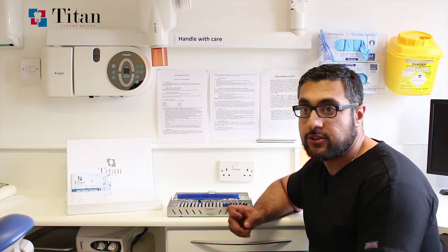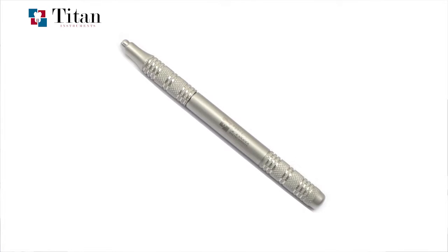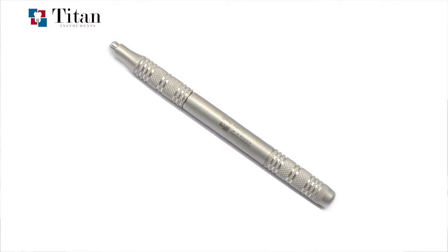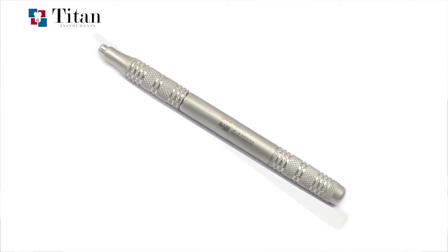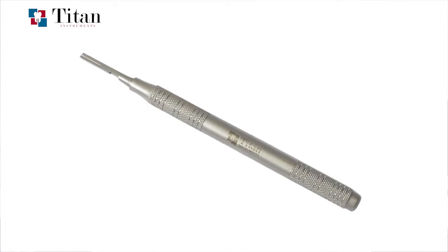In the second section we have two different types of scalpel handle — one is a Beaver-style micro scalpel handle that takes SM69 blades, and the second is a standard round scalpel handle which takes 15 or 15C blades depending on your preference.